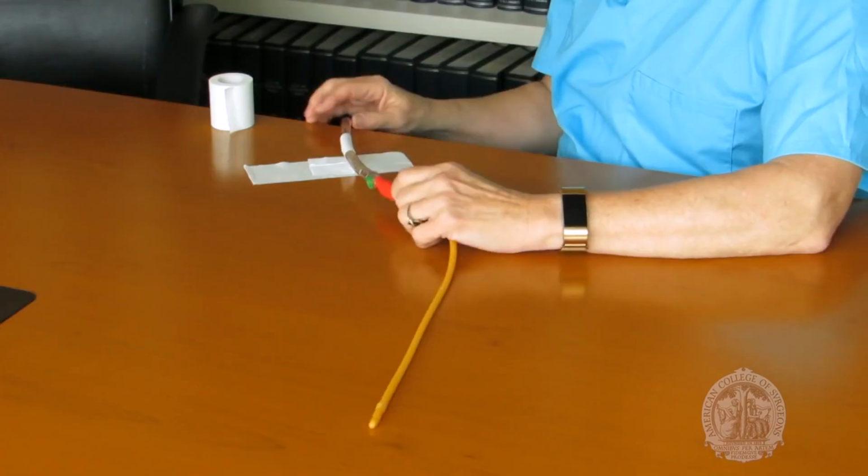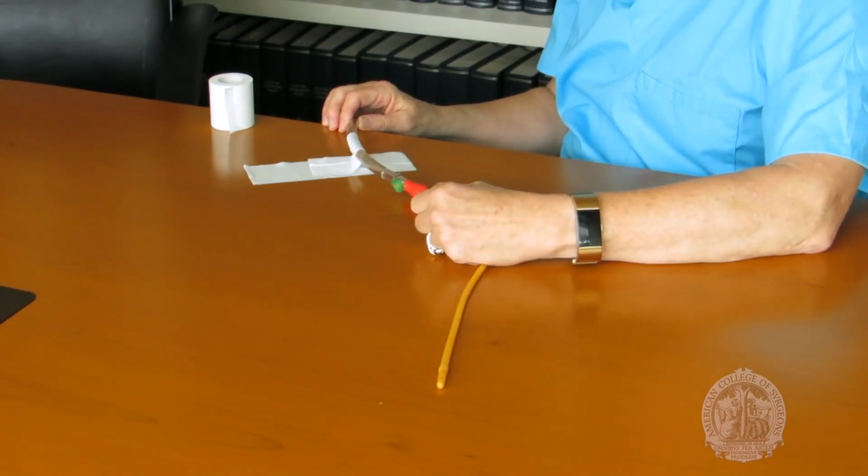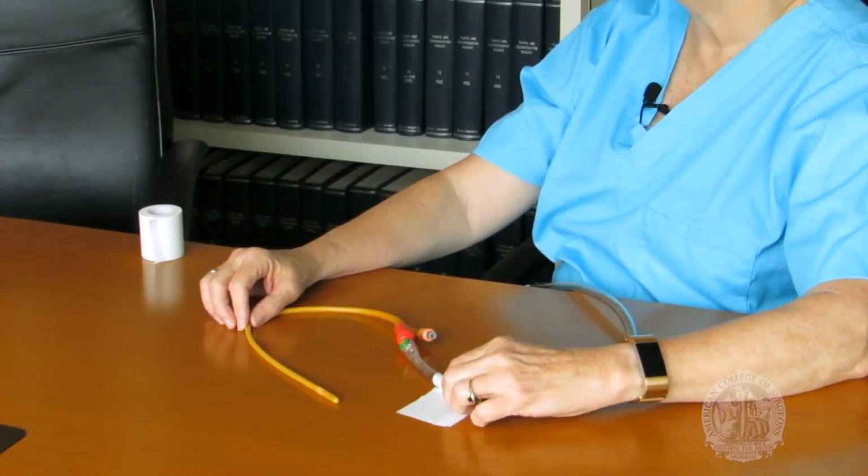Whether using tape or a commercial stabilization device, leave enough slack in the catheter and tubing so there's no tension on the bladder neck. Technically, the correct orientation is to secure the tubing so that the penis is cephalad and the tubing is taped to the abdomen. However, many people choose instead to secure the device to the patient's leg.